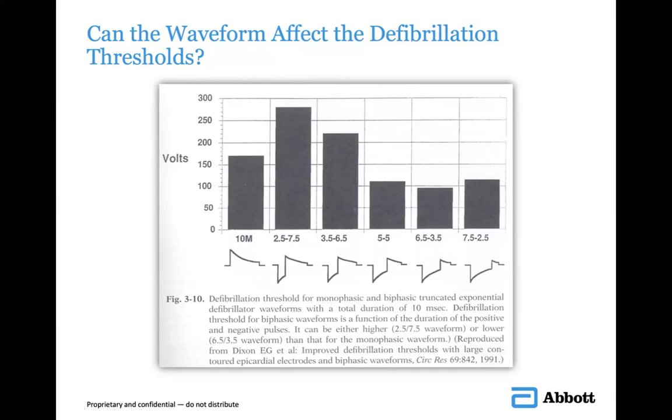And keep in mind that with monophasic, not only are you giving more voltage, so you're causing more electroporation or damage to the heart tissue, but monophasic itself at an equal energy output is shown to do more damage to the heart. So a big reason why, if you have both options in your hospital, I would say you may want to default, I'm not a physician, but you may want to look for the biphasic opportunity.